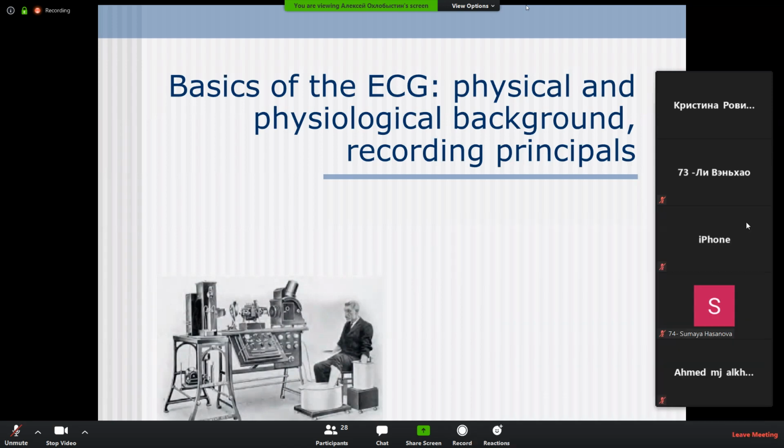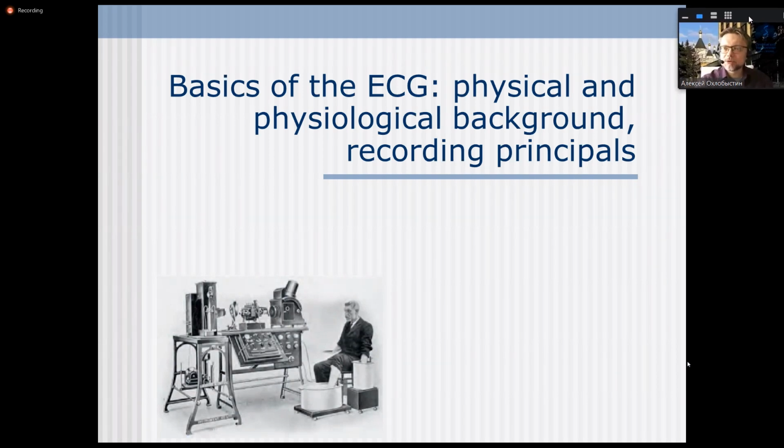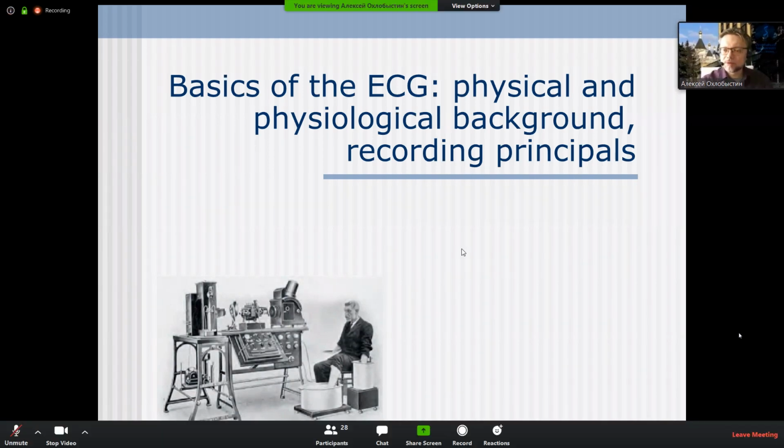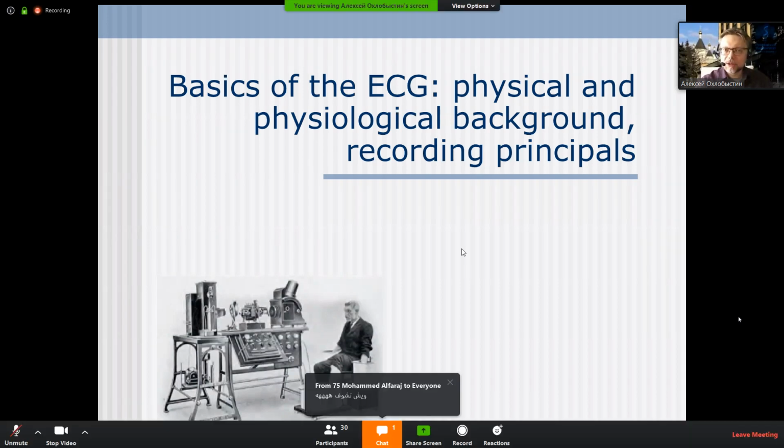When we record ECG, all those curves, all those deflections, what will be the significance of those? It's the electrical impulses of the heart at work. Which feature of cardiac activity? So, if, for instance, the ECG wave goes up, there will be an increase of what property of the heart? What will be increased, what will be exaggerated?